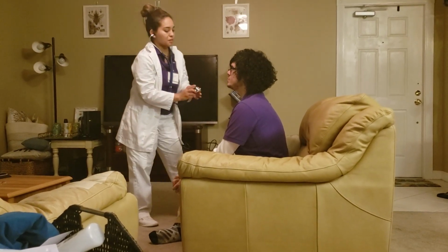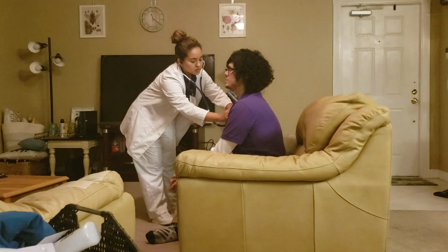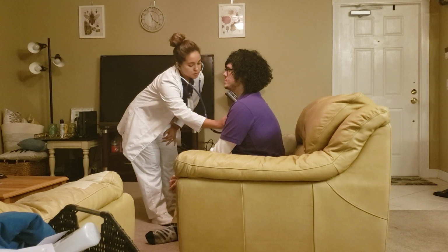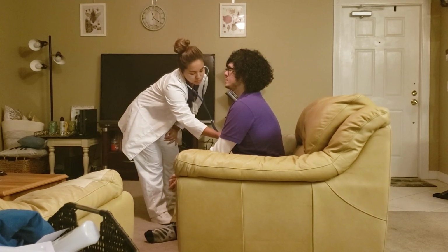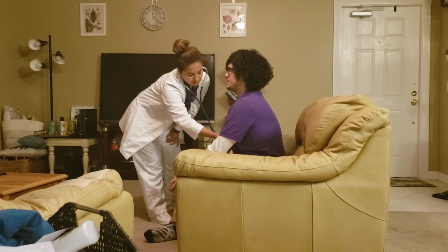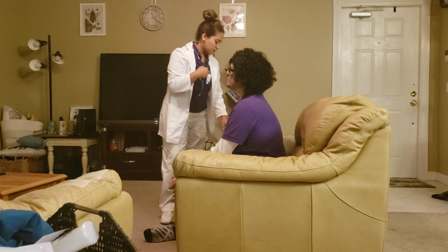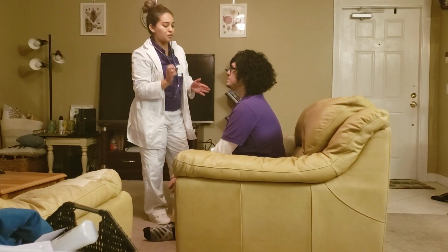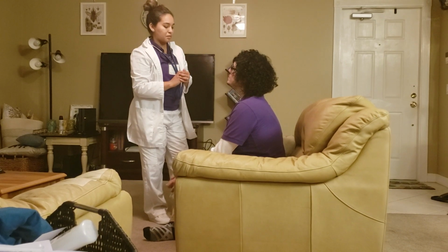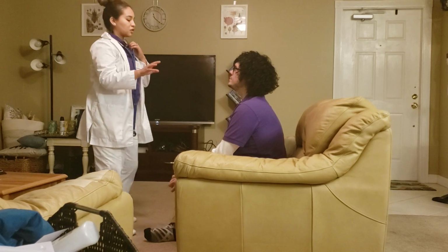Starting with the diaphragm, I'm going to go ahead and start at the aortic, pulmonic, which is the second intercostal space, Erb's point, tricuspid, and the mitral valve. In the mitral valve, I'm going to sit here and listen for a full minute. And the apical pulse I got, which was 70, and then I'm going to go back and do all 5 points again with my bell and making sure I'm listening to S1 and S2 sounds. Okay, so that concludes the heart sounds.